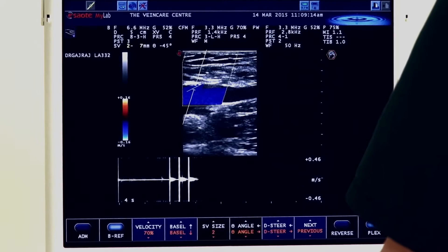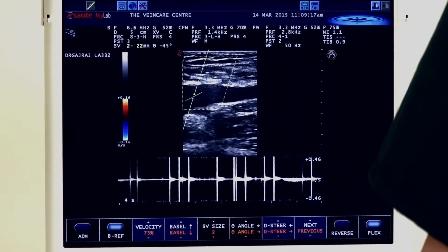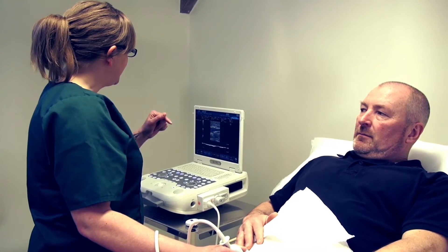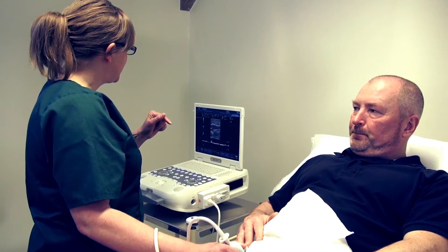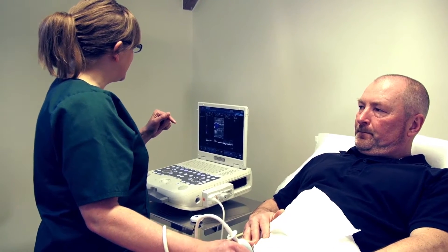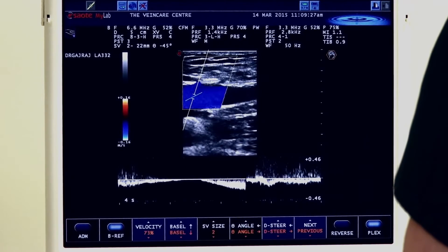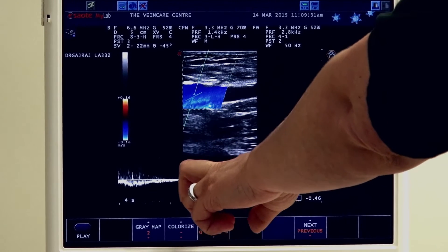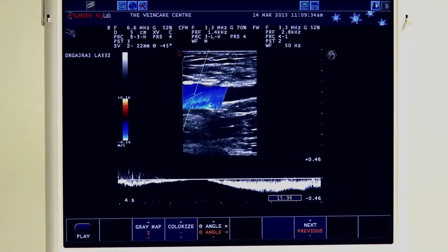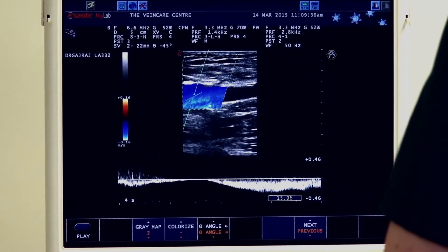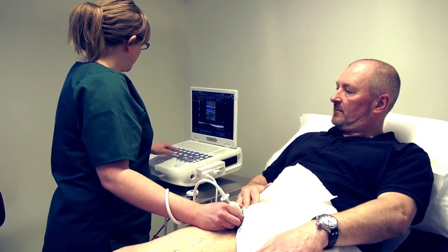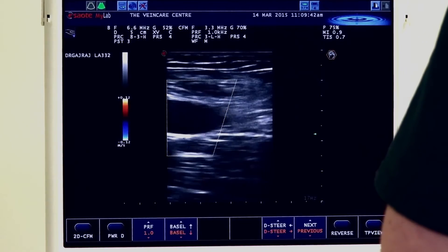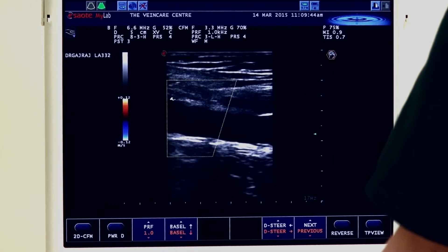Selecting the pulse wave. When you are ready, just take a nice deep breath in and push down as hard as you can. We can see complete cessation of flow. And then when Dave relaxed, you can see that nice wash of blood going back up towards the heart, which has demonstrated nice competency of those deep veins.